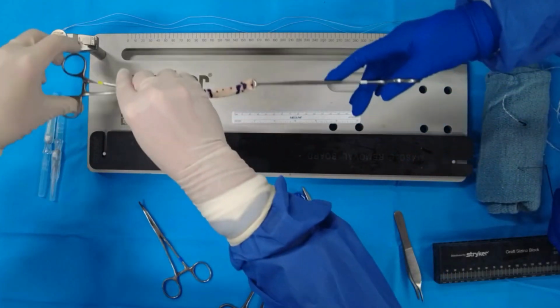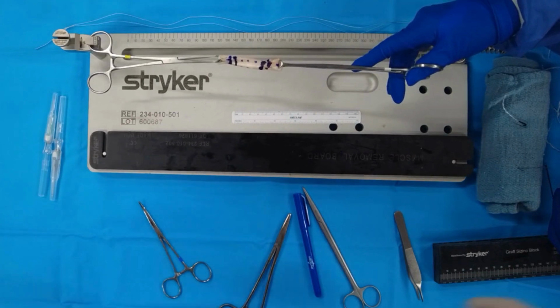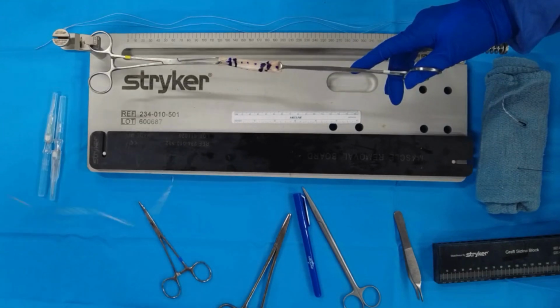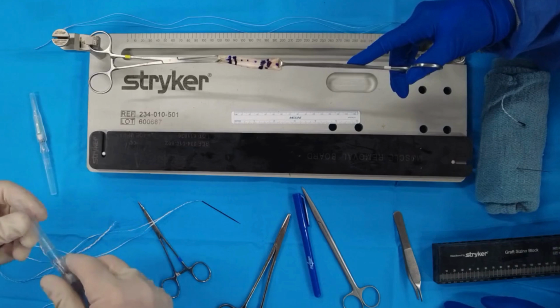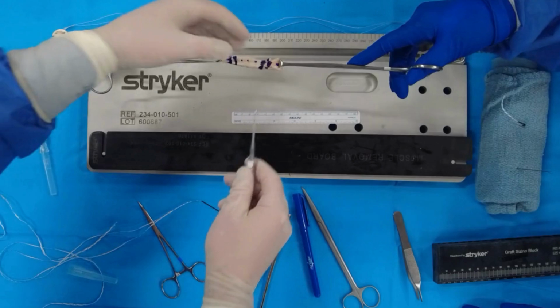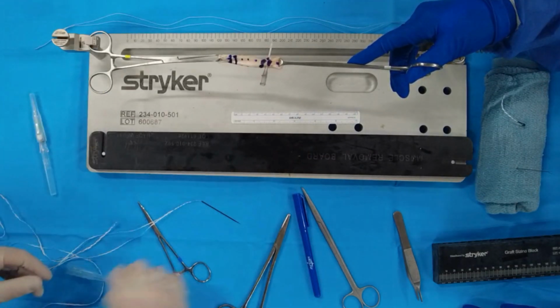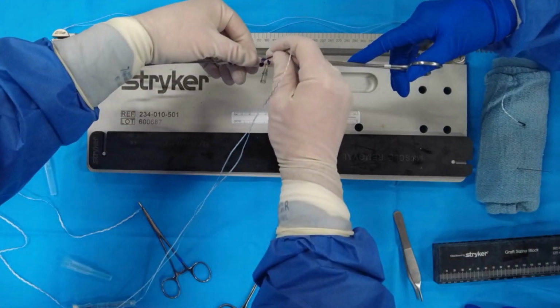And if you are going to use the loop suture tape technique, we're going to first place our needle at the 20 millimeter mark. And I'm going to put my 16-gauge angiocath in now. And I just do it on one side. If you do it on both, it tends to get in your way a little bit. And so I'm just going to do it one at a time. And we're going to first put our needle through at the 20 millimeter mark and push this through.